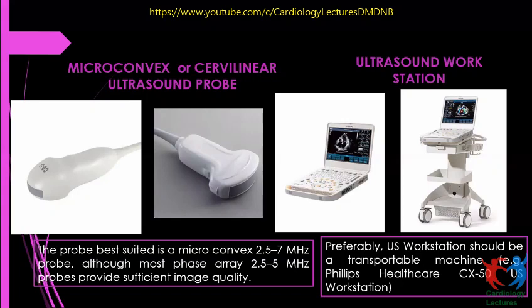If you have 2 ribs coming in your sector area, it is usually a little difficult to diagnose. If you have a bigger surface of ultrasound probe like a curvilinear probe, it gives you a more accurate evaluative sector for the diagnosis.